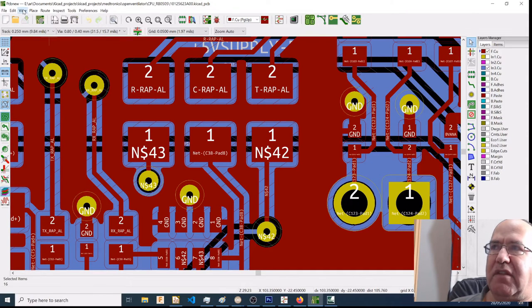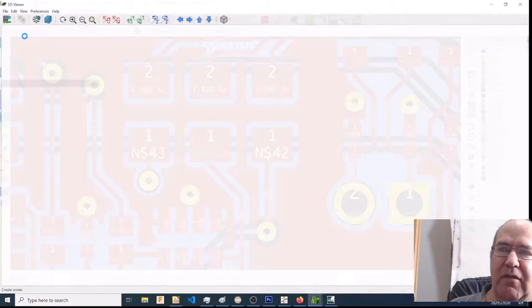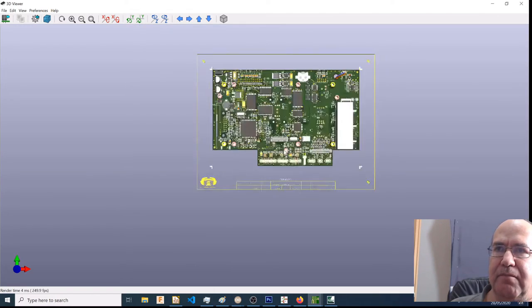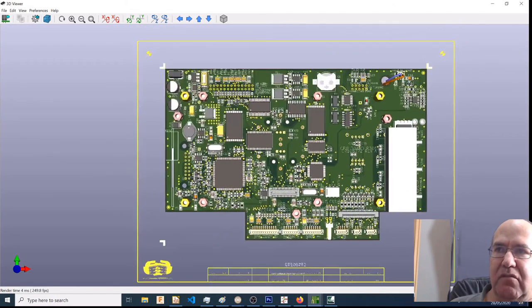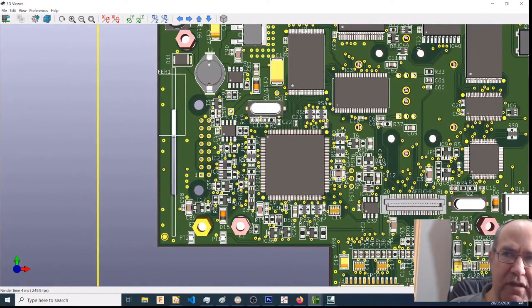If I'm looking at this on the 3D view, it takes a few seconds, it's not a small board. Here is T20. Here is the back EMF diode.